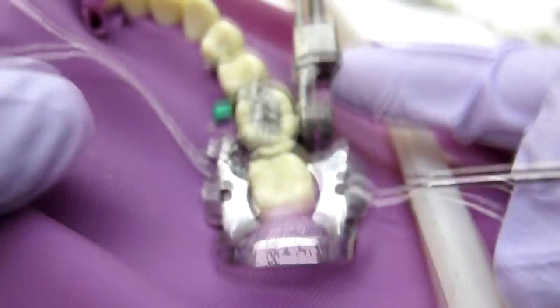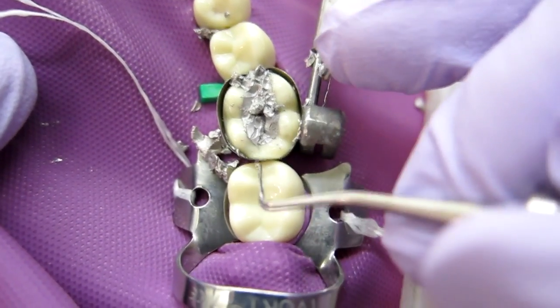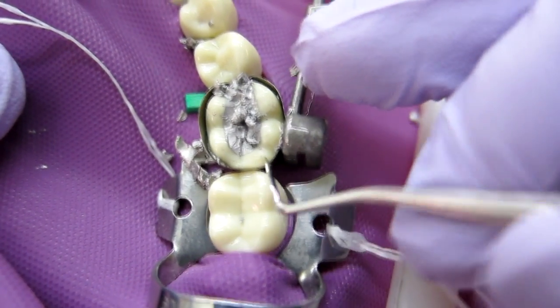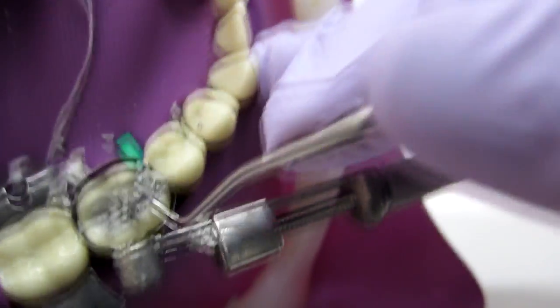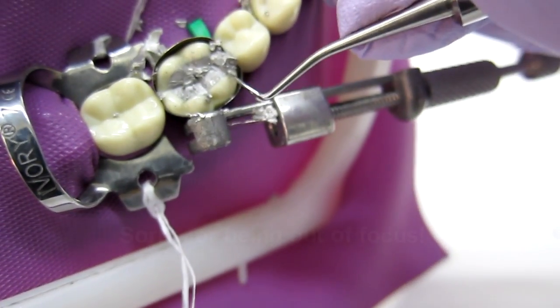In the mouth you'll have to figure out how to position your hands to get into the areas. I'm doing the distal cusp, and then this one — always remember, you don't want your marginal ridge to break, so carve away from the marginal ridge.